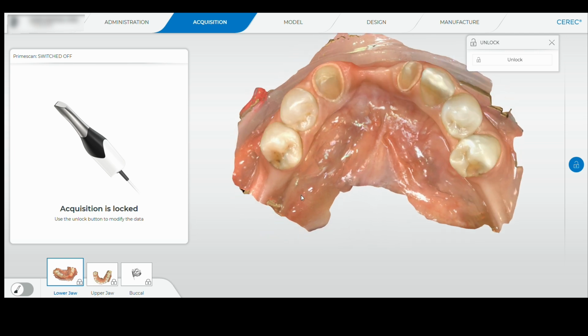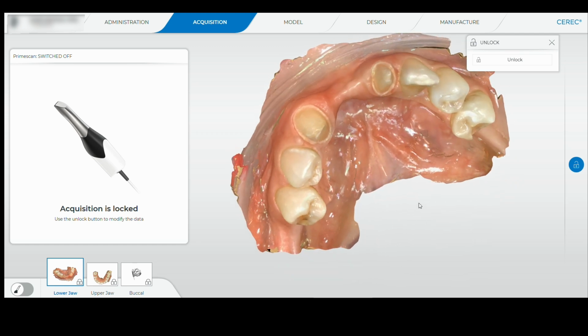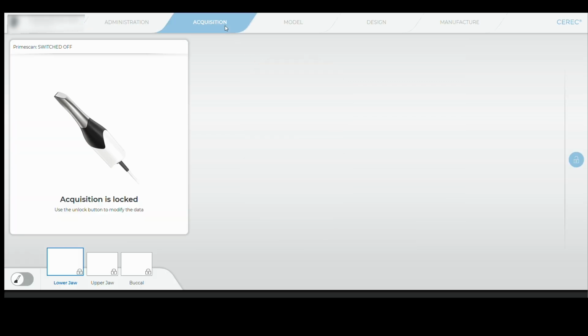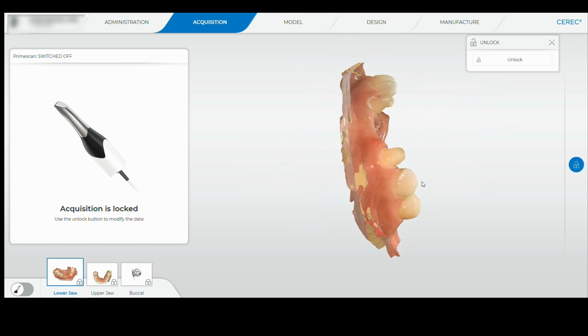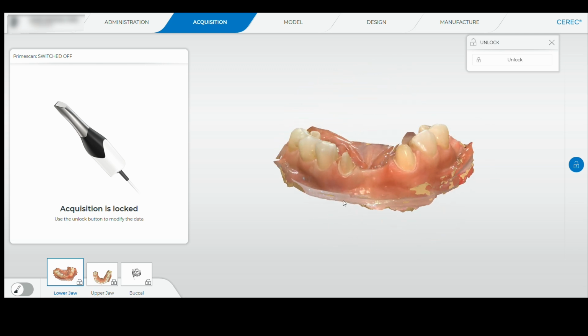So this particular patient had missing teeth down on the lower front right here. These two teeth were missing down on the bottom, and she did not have enough bone for implants. So we chose to do a bridge, which is a perfectly great option, sometimes cheaper for the patient as well. So you can see my digital scan of the patient's prepped teeth for a bridge. Now, this machine is very unique in the sense that I can actually determine the color of the teeth, the color of the materials I'm going to use from the actual scans that I do.